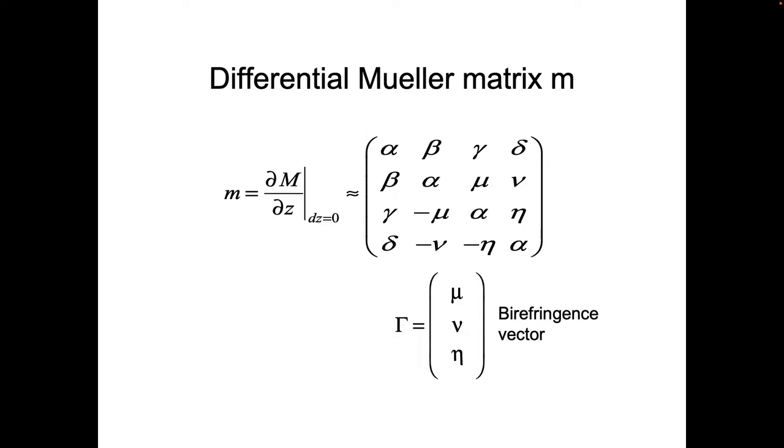And so, what does it mean? For an arbitrary matrix, it boils down to this form. This one I have explained, that is just the attenuation of the beam. This part is your diattenuation. It's that one polarization state weakens more than another one. Okay, it's a loss of energy, because it's absorption. This part is now the one that completely covers birefringence. And if you look at it, it's a rotation matrix. From this rotation matrix, I can extract this part here, mu and eta, as a three-parameter thing. And this three-parameter thing, I can now write as a vector. I'll slow down if you want to keep the notes.